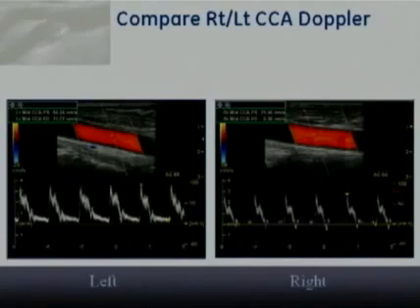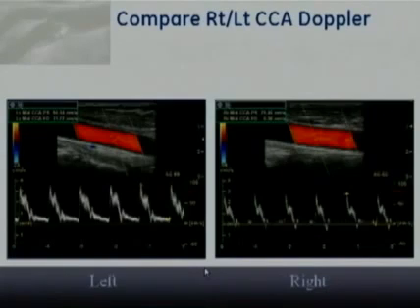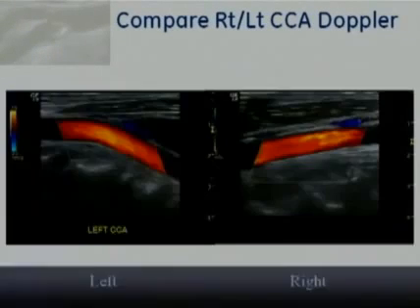Now that could be an ICA occlusion, which is probably the most likely event, but it could also be that there is a stenosis that's intracranial, and the most likely location intracranial would be at the carotid siphon level. And in this particular case, it was just beyond the siphon, and we have this high-grade stenosis within the middle cerebral artery. Now, we won't see changes down at the common carotid from an intracranial stenosis unless the stenosis is at least 70% diameter reduced. And of course, this is much more than that.